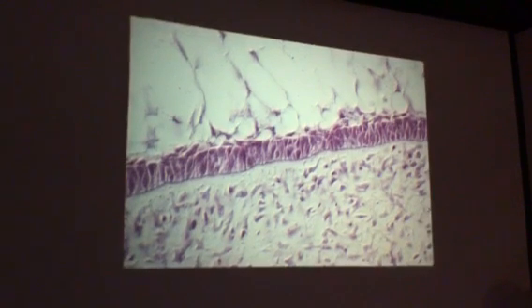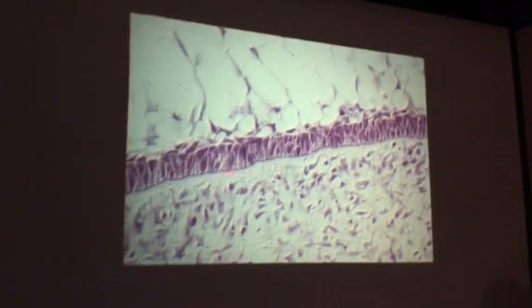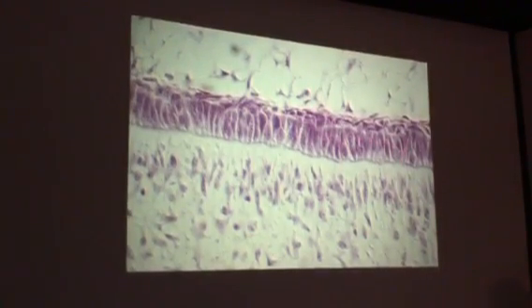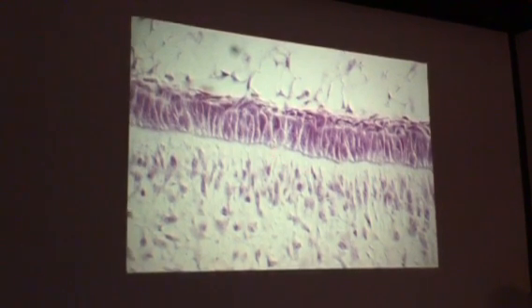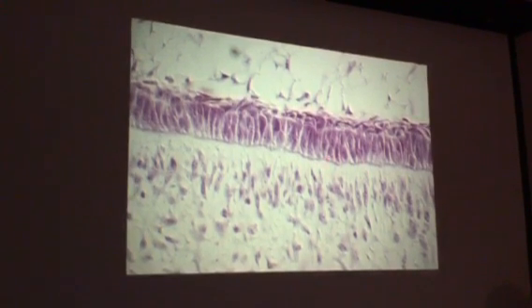So for a slide like this, if I were to put the pointer down here, away from any of these differentiating cells, then that would be morphogenic. Well, yeah, morphogenic. I'd give you something more distinctive, something more like this, and these would be what? Organizing. You can just see those odontoblasts reaching up, start to poke those odontoblastic processes up there and actively laying down that dentin to start to recede away from that boundary. This kind of makes histology come alive.